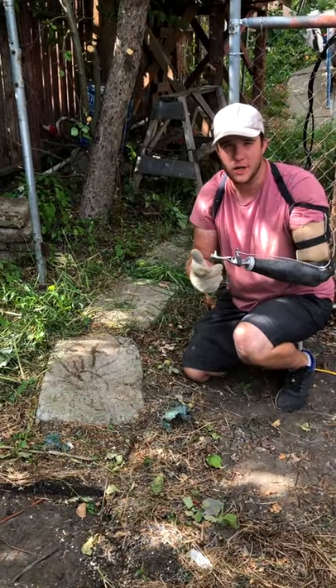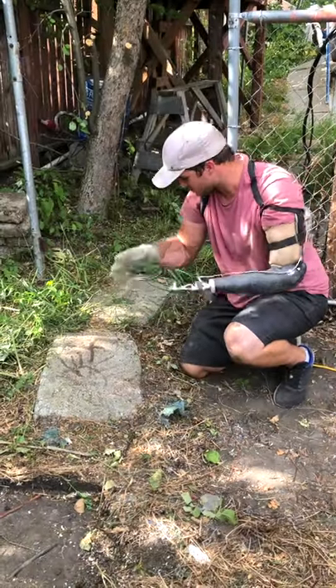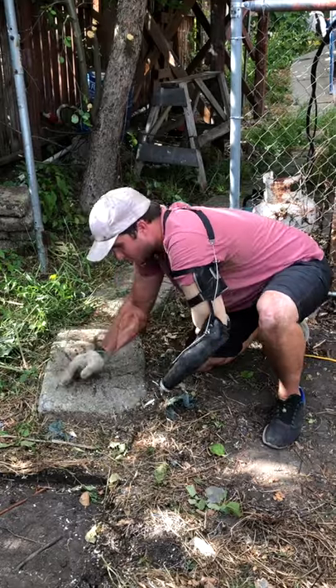There's a lot of things that are really hard to do with my hook, but in a lot of cases this thing is pretty handy — pun intended. So for example, I'm trying to get this paver stone out of the ground and it's really hard to dig around it and pull out.